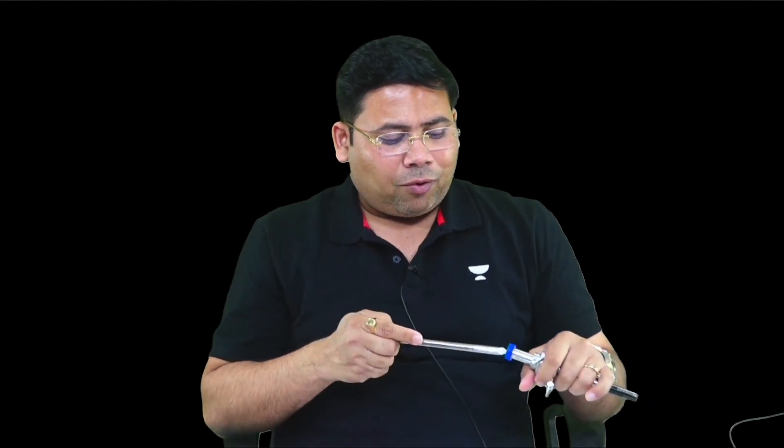This trocar and cannula together is known as a port. This is an inlet for CO2 — you can allow CO2 to go in, leave it closed, or vent the gas out. How to hold a port is very important: a port is always held in a pistol form. It is the thenar eminence that gives you the strength to penetrate inside.